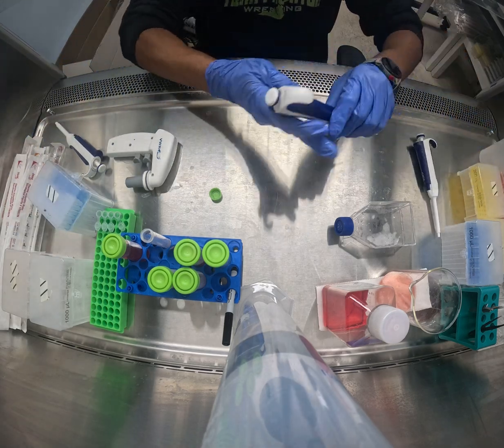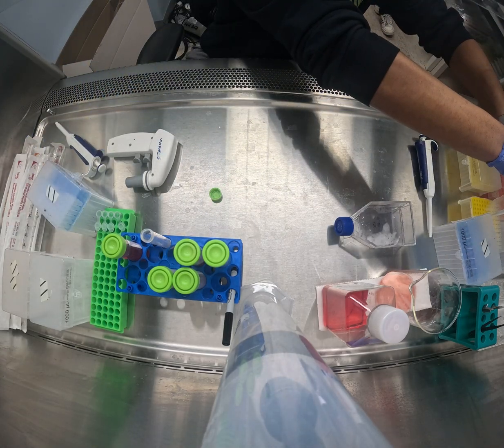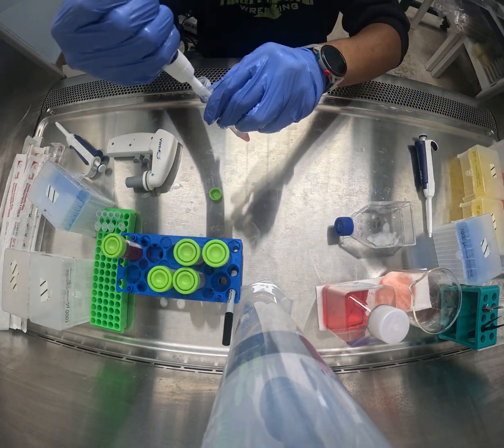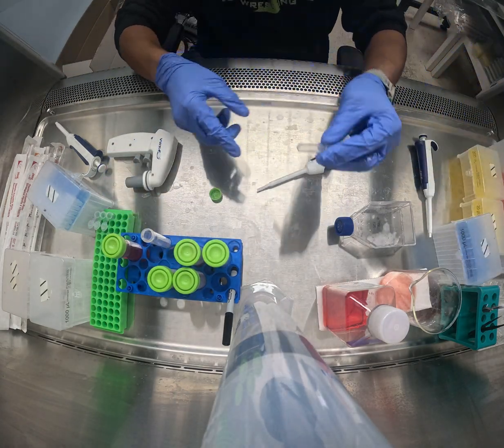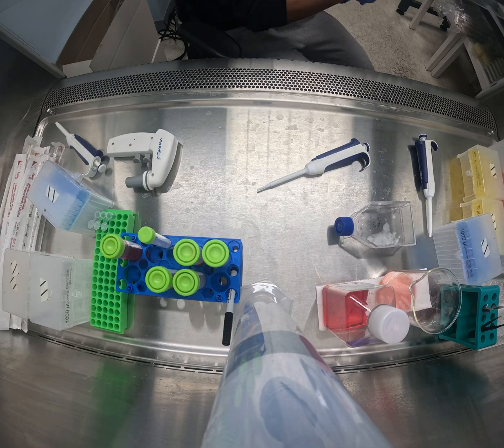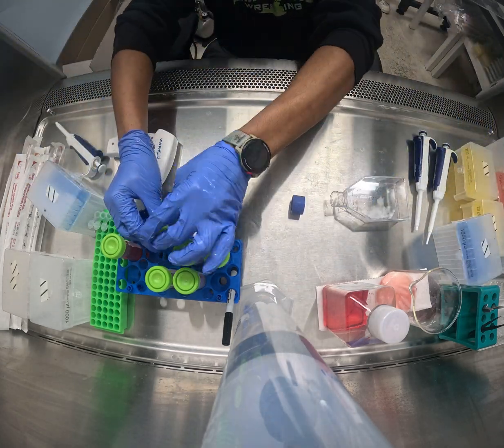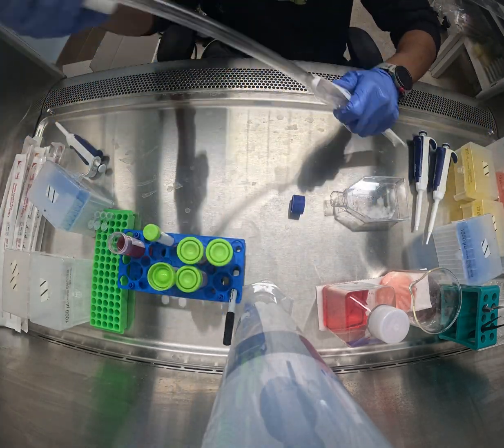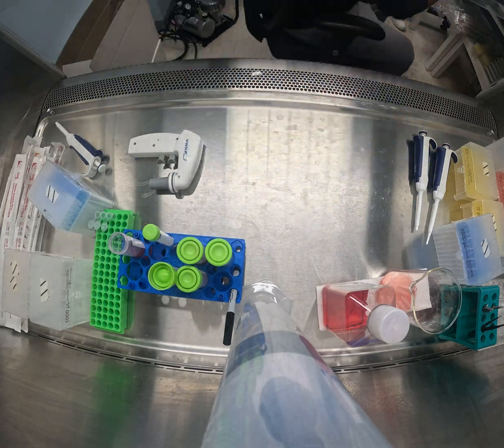From here, you will take 10 microliters for cell counting. After diluting yourself to the proper concentration needed or ensuring viability, take 50 to 100 microliters of the cells in the 15 milliliter vial and place them back into a large flask. Once placed, fill the large flask with 15 milliliters of complete medium. The remaining amount in the 15 milliliter vial can be discarded in the biohazard bin.